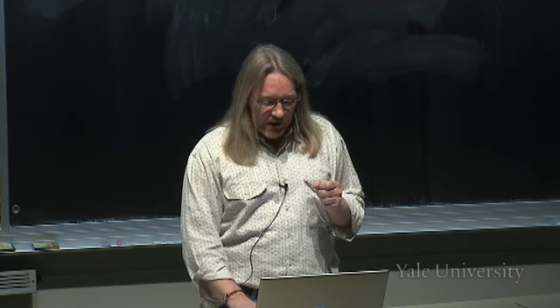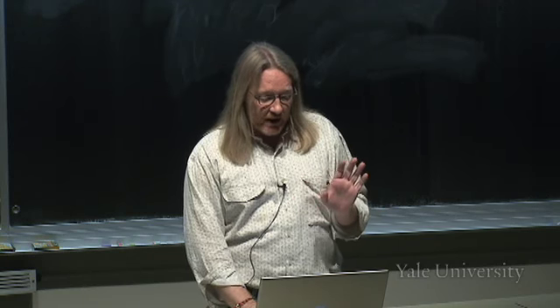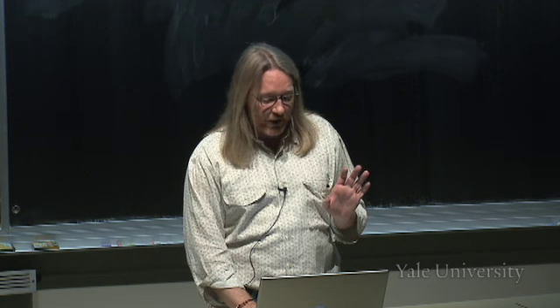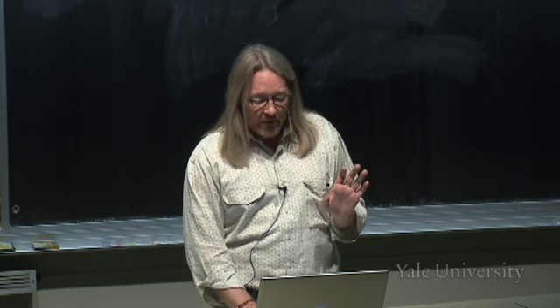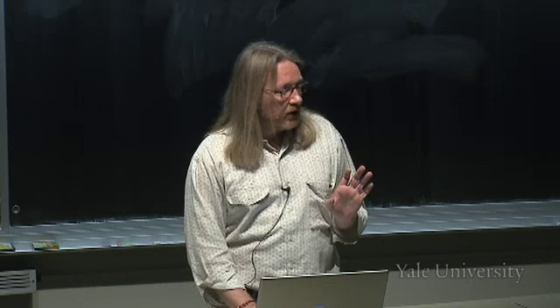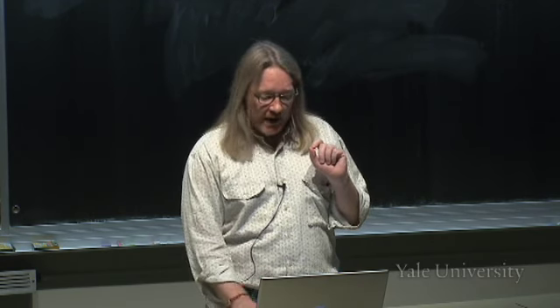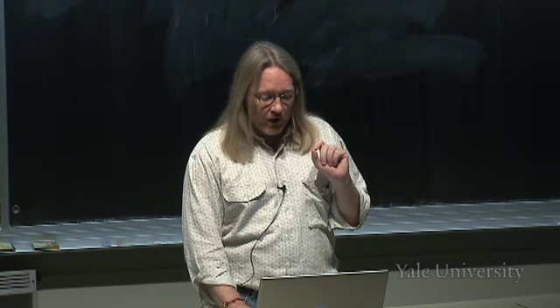So an experiment that, well, the other thing about fMRI before I talk about the experiment is that instead of just looking at anatomy now, this is a high resolution picture of the anatomy of the brain, an fMRI image is fuzzier. You don't have as high a resolution. And that's because you want to take images fast. You don't want to wait a long time. And you want to see how the image changes with time.